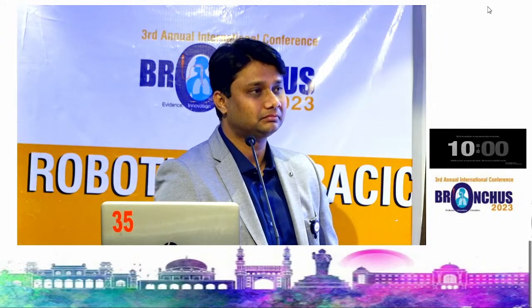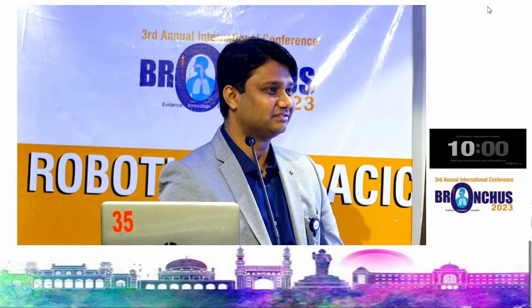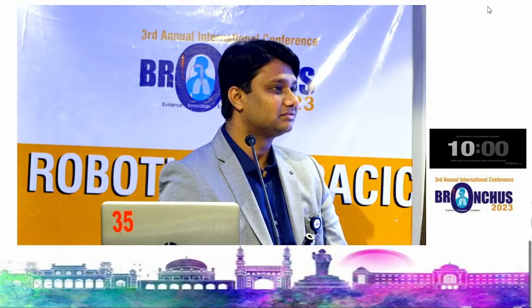And if you are dealing with apical adhesions, we don't remove the apical adhesions initially. I go to the hilum, dissect out the hilum, everything, and then at the last, it acts like an actual retractor for my lobe. And the inferior pulmonary ligament is released so that your post-op space problems are reduced. So whether you do it at the beginning or at the end, we are not compromising the principles of the surgery itself.